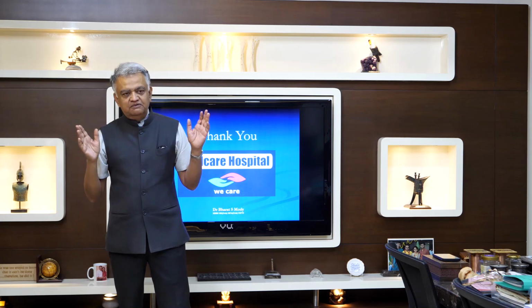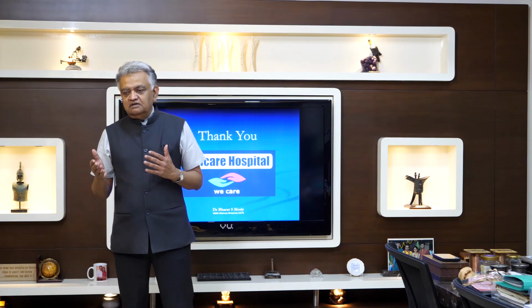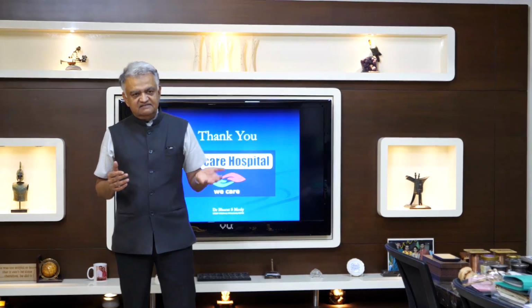Okay, good. So, just to synopsize, what have you done today? This was a long version of it. What you have done today is taking off from the ski slope of the history of knee implants. You understood how we arrived at the major blocks of implants that you have commercially available. Fixed bearing, and we are talking only about total implants, so not unicompartmental. So you have the fixed bearing, cruciate retaining and cruciate sacrificing. You could have the mobile bearing, which you understood why mobile bearing has some merits to it. You heard that there are something called material-based distinct implants like the ceramics. And then you lastly saw the slide of the medial pivot.